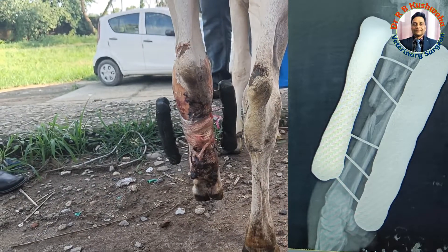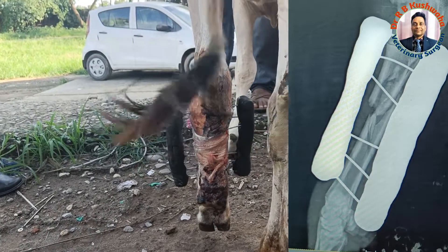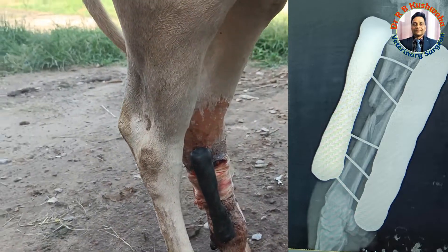This fracture was above the mid shaft — in other words, this is a compound proximal one-third diaphyseal fracture of the left metatarsal.